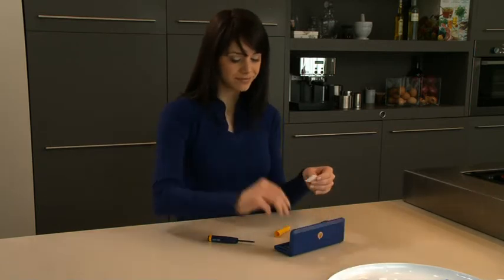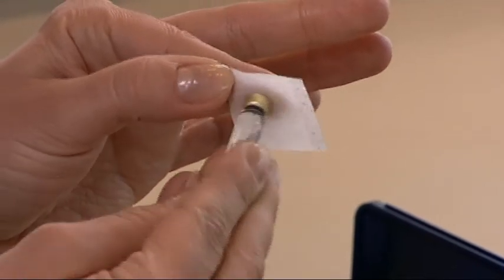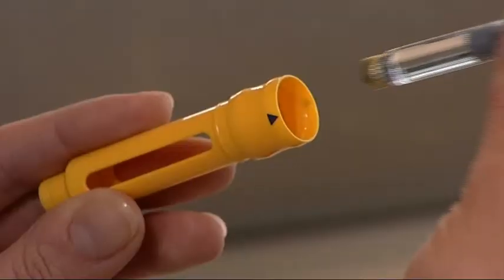Use an alcohol swab to gently wipe the metal inlay on the cartridge, then insert the Puragon cartridge into the yellow cartridge holder. Make sure that the metal rimmed cap goes in first.